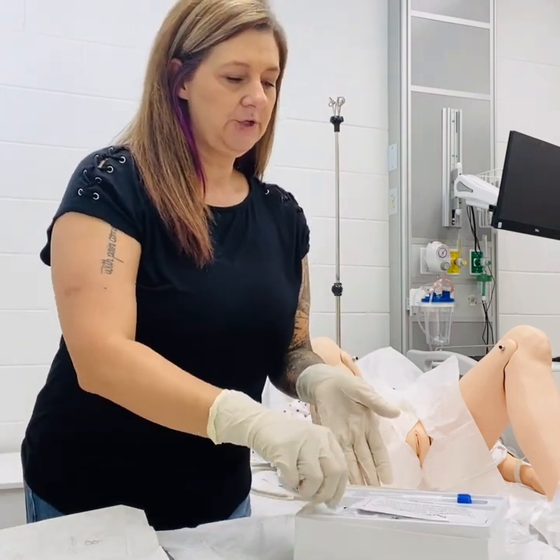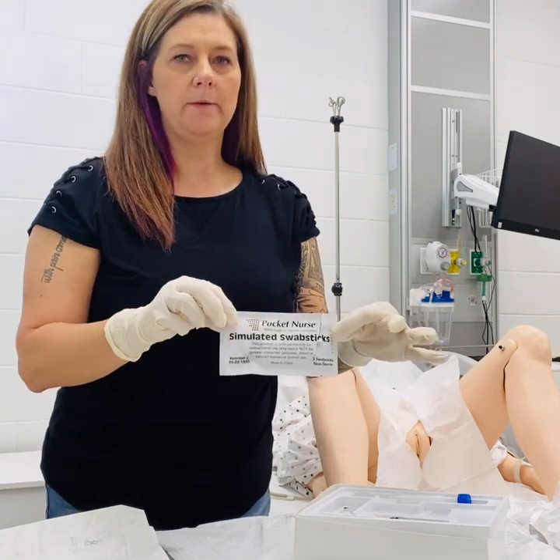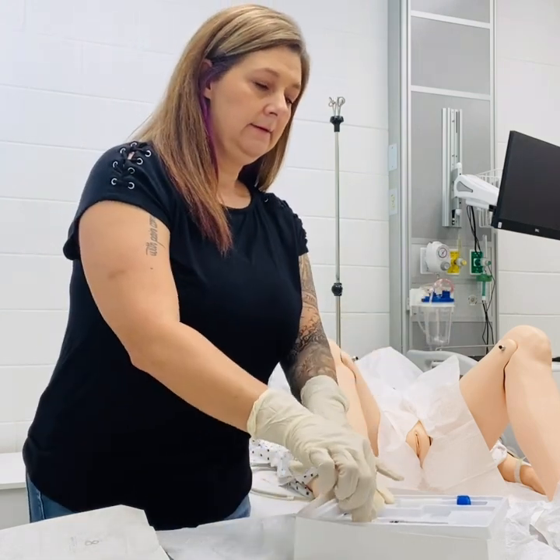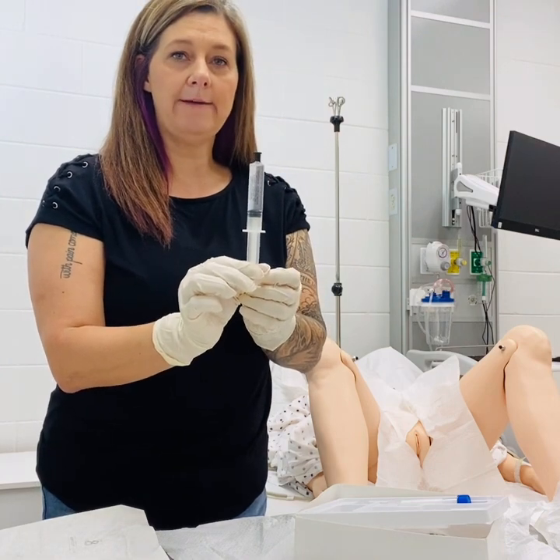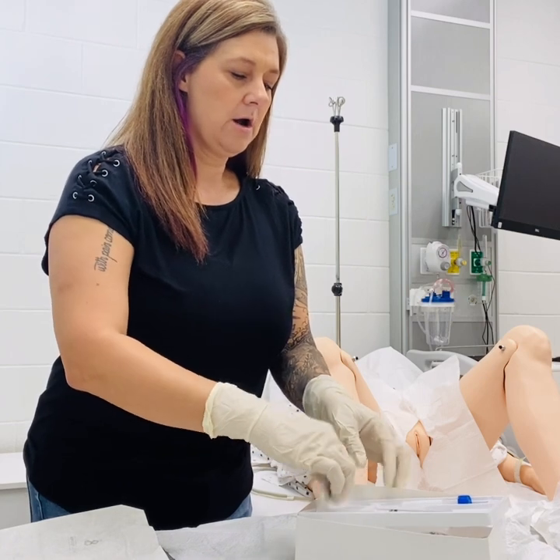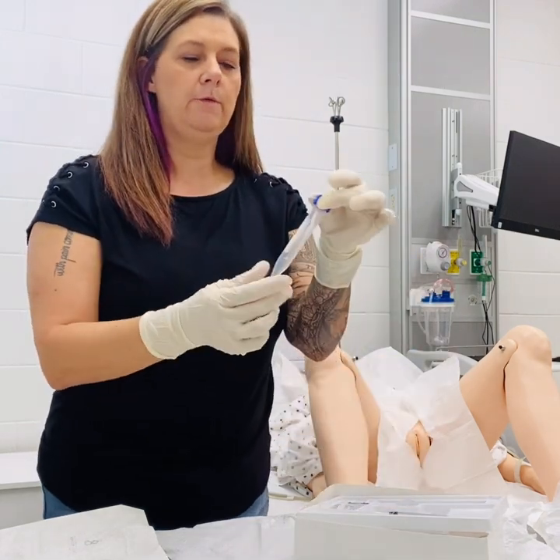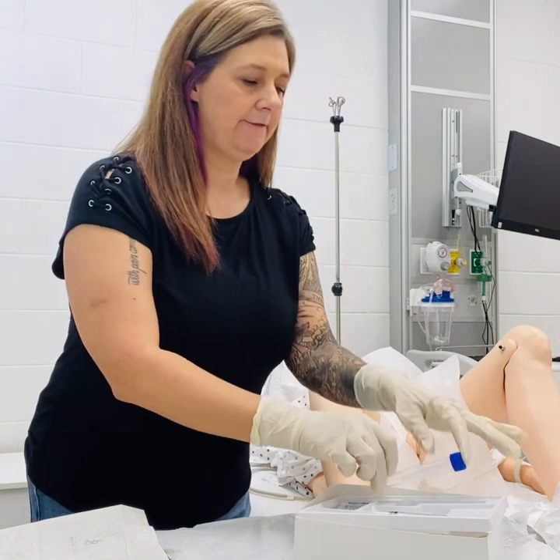Inside our package, we have our betadine swab sticks, so you always want to verify the patient has no allergies to betadine prior to beginning. We have our saline to inflate the bulb after insertion. We have our lubrication to place on the end of the catheter tip prior to insertion. And then you have a tube for specimen collection, if needed, to send to lab after insertion.